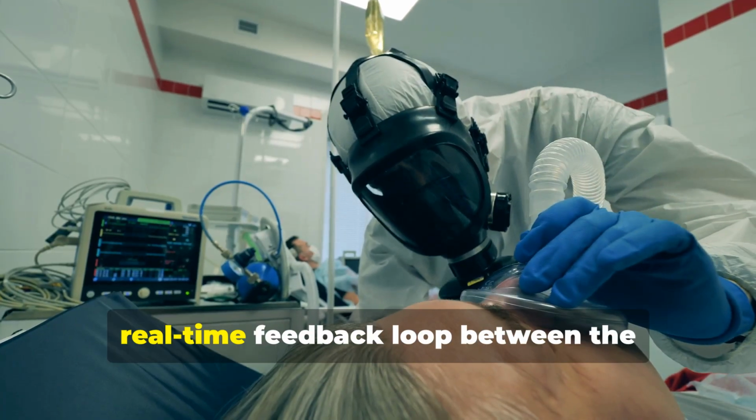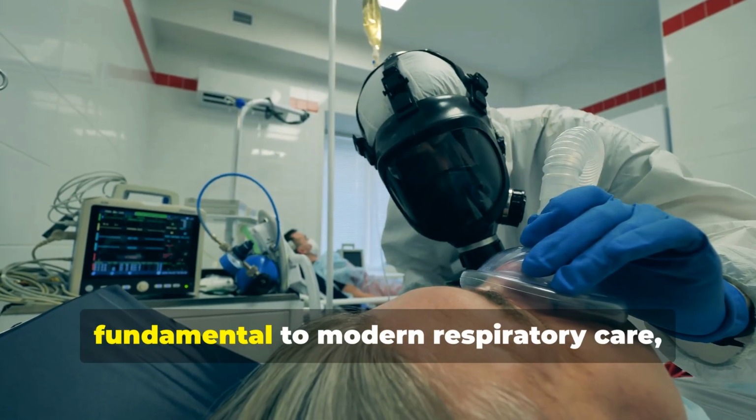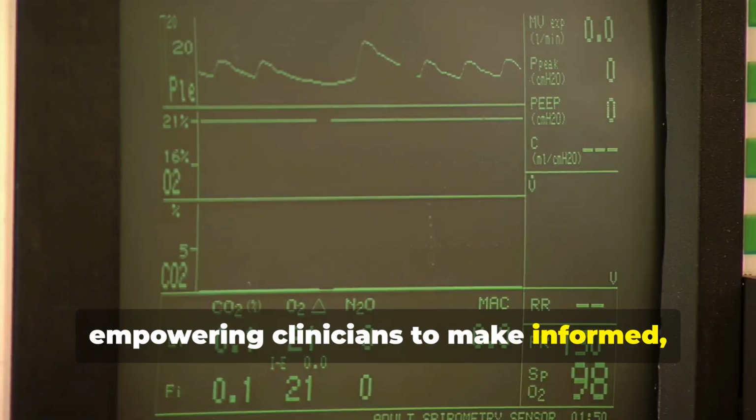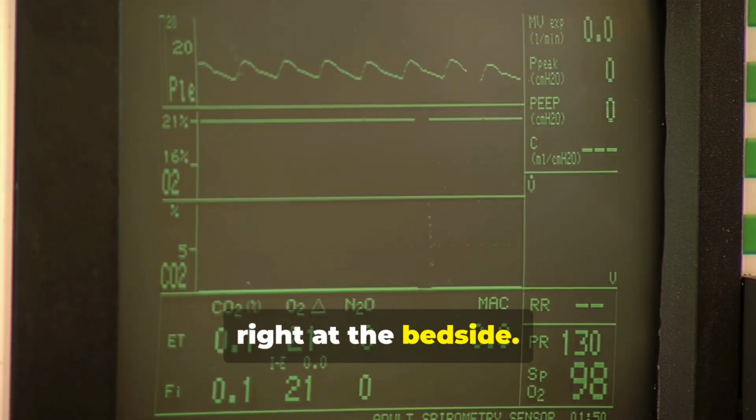This continuous, real-time feedback loop between the patient and the ventilator is fundamental to modern respiratory care, empowering clinicians to make informed, proactive decisions quickly and confidently, right at the bedside.